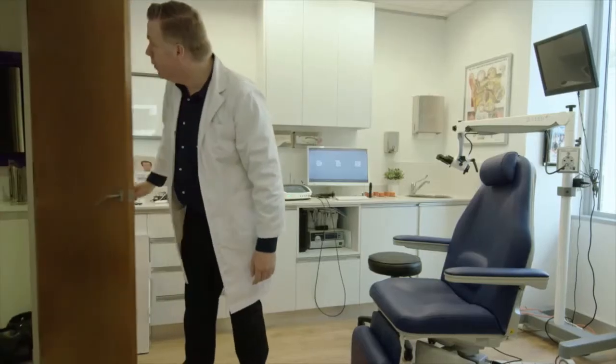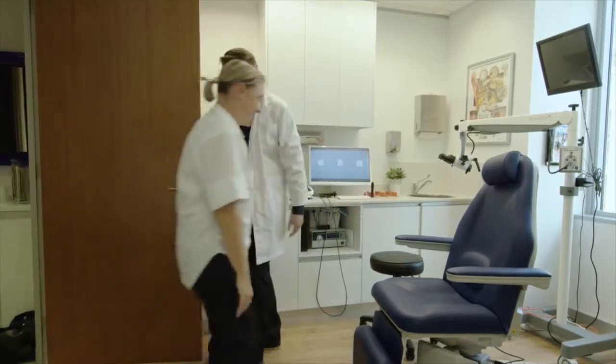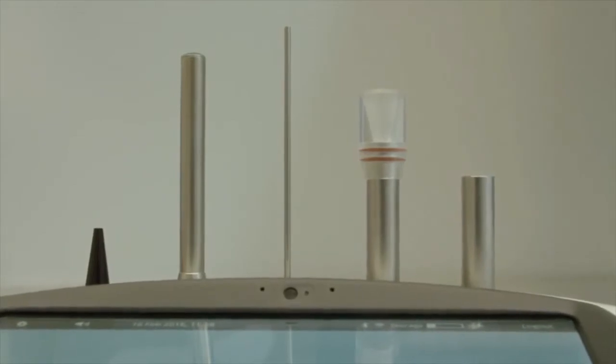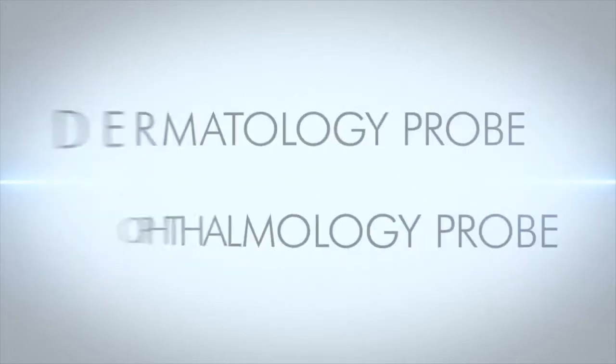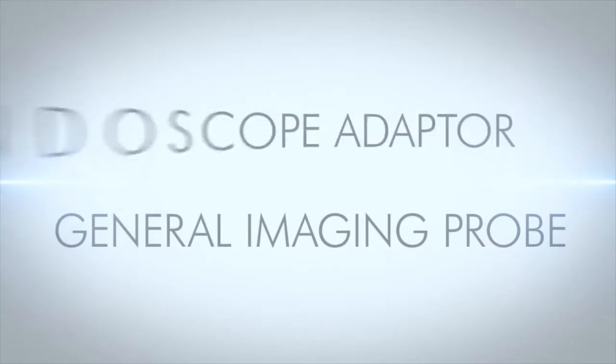The Pro-EX has been designed as a universal platform for all your patient imaging examination requirements. The Pro-EX supports multiple medical probes for a wide range of examinations including otoscopy, ophthalmology, dermatology, dental, urology, general imaging and endoscopy.